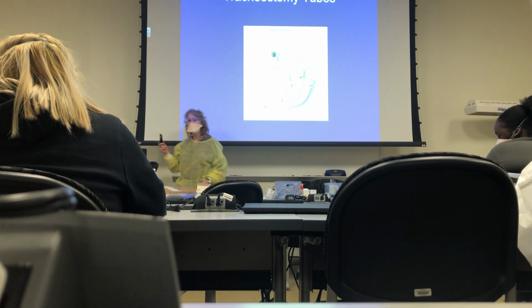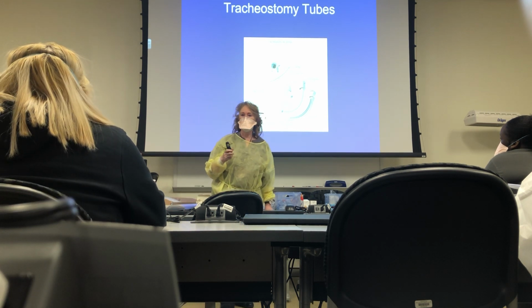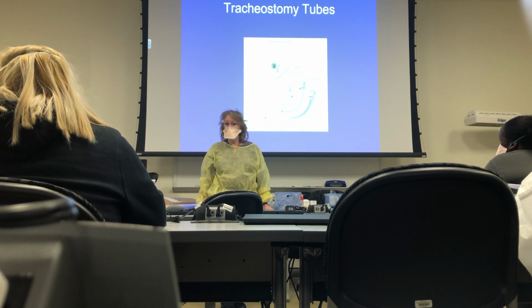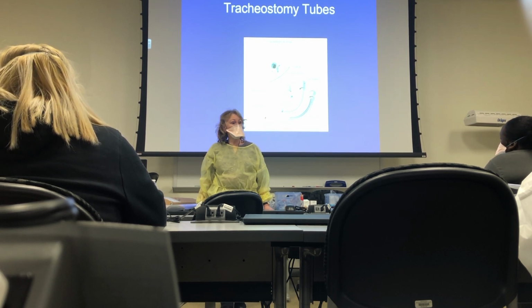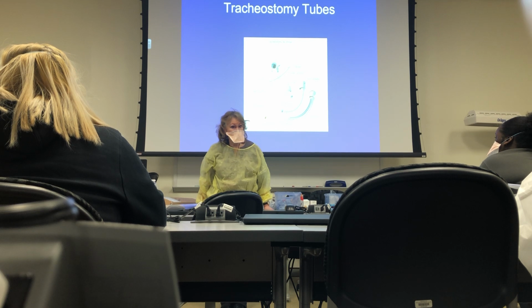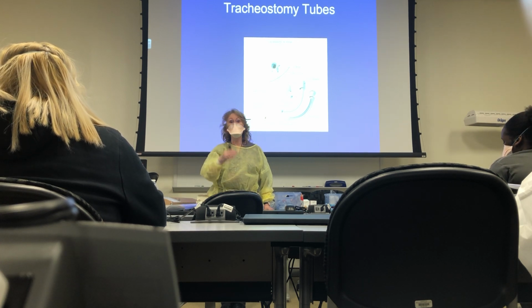Guys, there never used to be inner cannulas on trachs. So what's good about having an inner cannula on a trach? If they can be changed. Why would you want to be able to change it? Think about a trach that didn't have an inner cannula and one that does. A lot of secretions, dried up secretions. Could the trach plug? If you don't have an inner cannula and that trach plugs, you have to take that trach out of the patient, where the physician does, in an emergency, okay? This way you just pull out the inner cannula and put in a new inner cannula. It's part of the trach here.